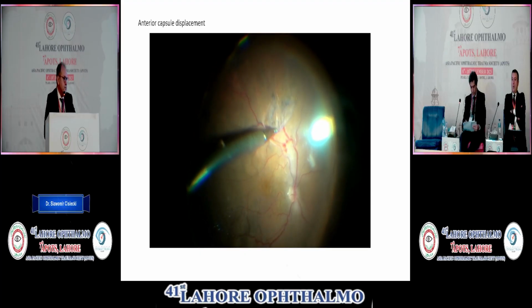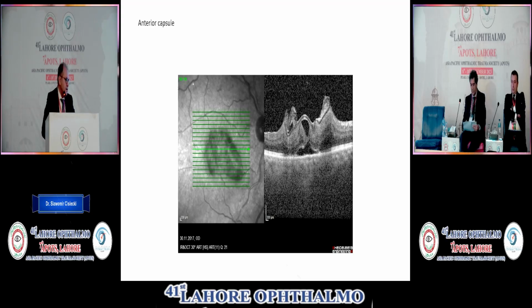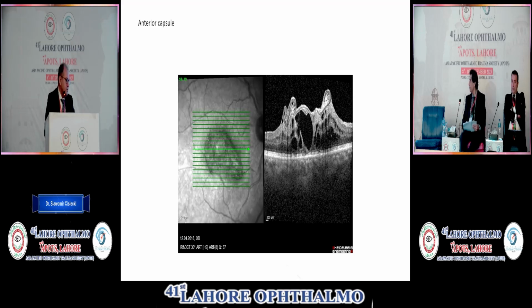I removed the silicone oil and exchanged it for air, and this is how it looks 1 day post-operation, 1 month, and 1 year after the operation. The patient refused any other surgery and suffered for 3 years.